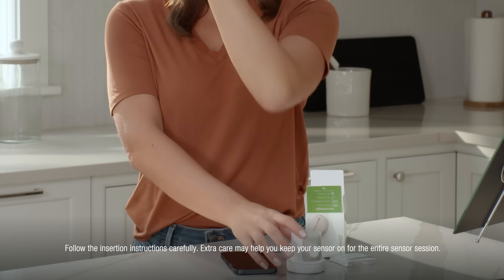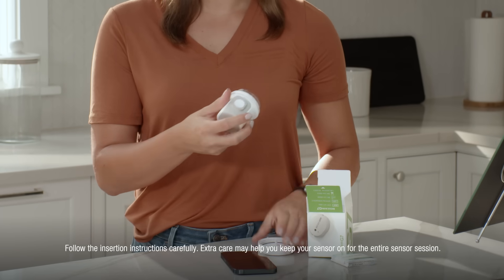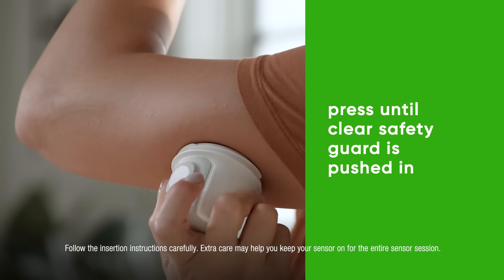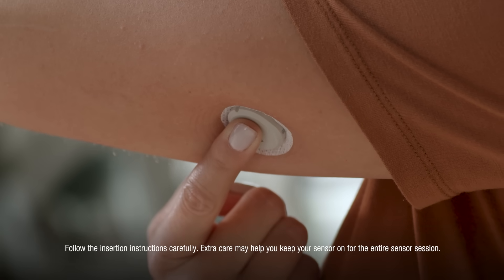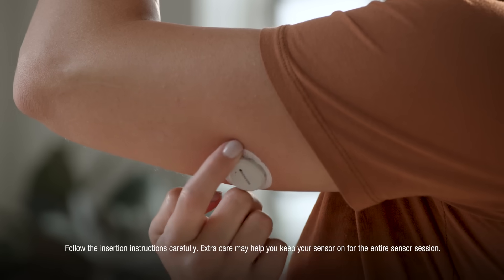Grab your applicator and unscrew the cap. Don't touch inside the applicator. Press and hold the applicator firmly against your skin, then push the button and remove the applicator. To help keep the patch on your skin, press on the sensor for 10 seconds, then rub around the patch three times.